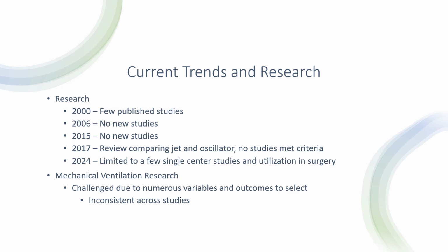In 2017, Cochrane attempted to compare the jet ventilator to high-frequency oscillatory ventilator, but no studies met the inclusion criteria. As of 2024, a literature search for high-frequency ventilation remains limited to its application during certain surgical procedures like bronchoscopy and ENT procedures, although this utilizes a different device, approach, and only utilized during the procedure. Other results provide the results of single-center studies.